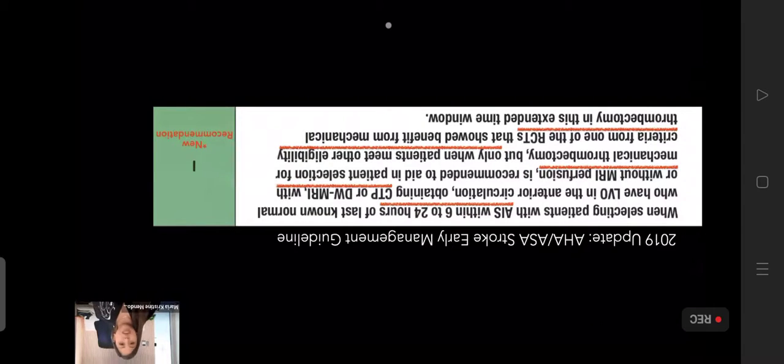So for patients within 6 to 24 hours, additional imaging of CT or MR perfusion may be done again to determine eligibility. And this is actually based on the trials of DEFUSE 3 and DAWN, wherein they determine quantitatively the extent of infarction and also the presence of the ratio between the core and the penumbra to know if the patient would still benefit from thrombectomy.